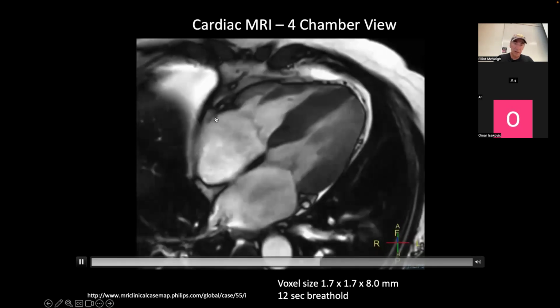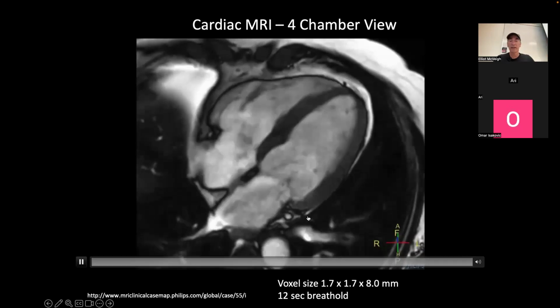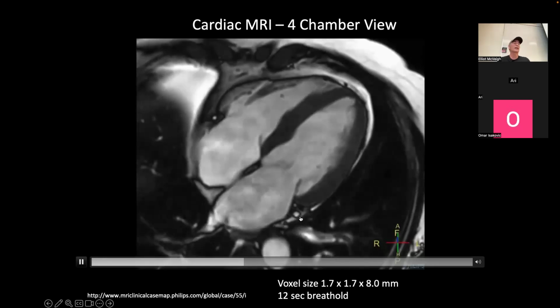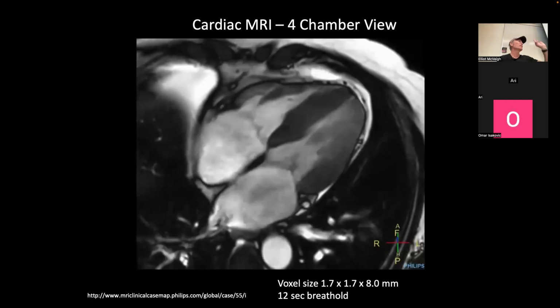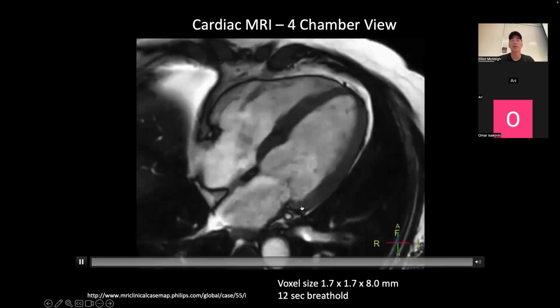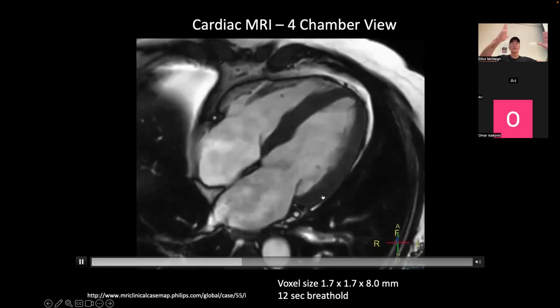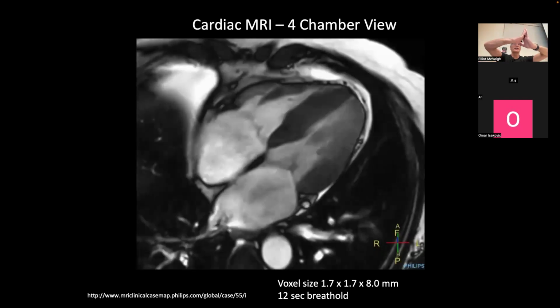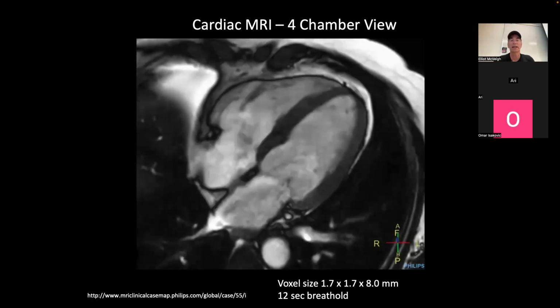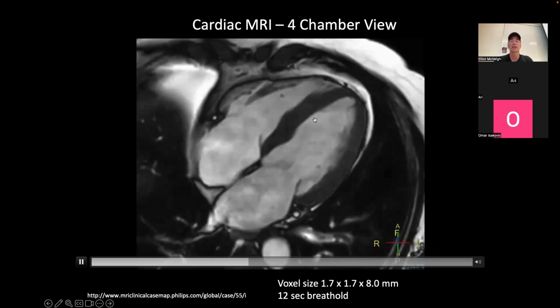Again, that is a coronary vessel. That's the right coronary vessel running around the back. You have that big thing right there. The big circular thing is the cardiac vein. It's the great cardiac vein, which is a really large diameter vessel. And then beside it is the coronary artery. You see really nice depiction of the valves and how they coapt nicely. And then when they open, they sort of rock back and forth. So you get that dynamics. Again, you get myocardial thickening, really well sampled here.